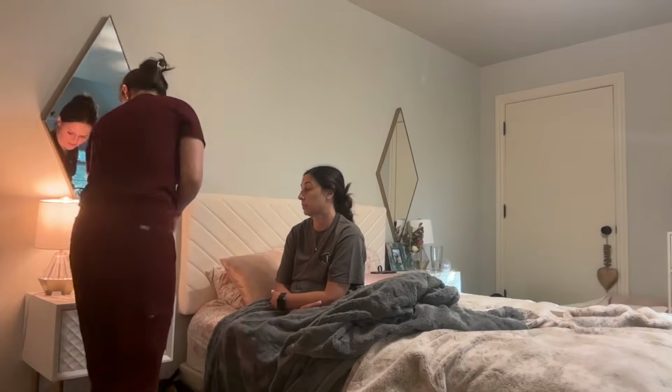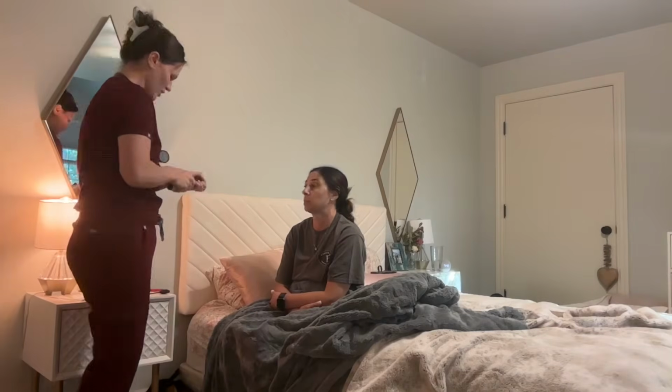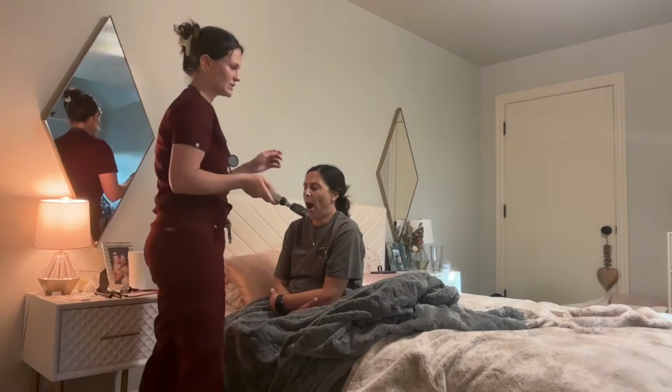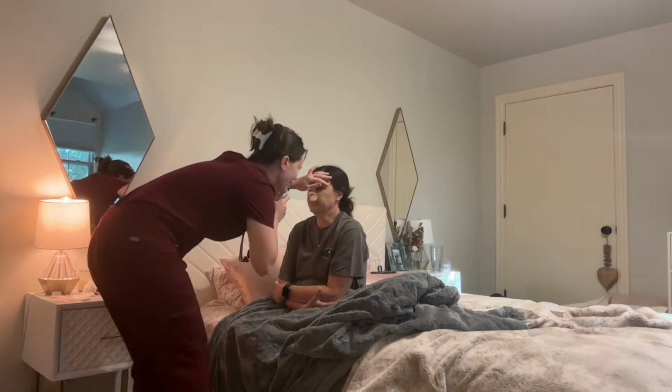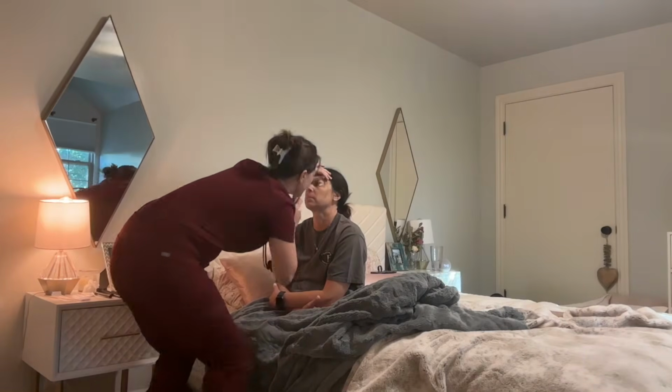And then next we are going to assess the optic disc, making sure that the margins are nice and sharp on it as well, with the red reflex. With this, we are looking for any signs of papilledema, hemorrhages, or exudates.